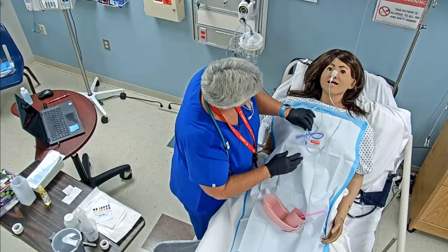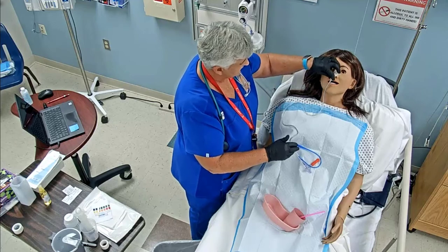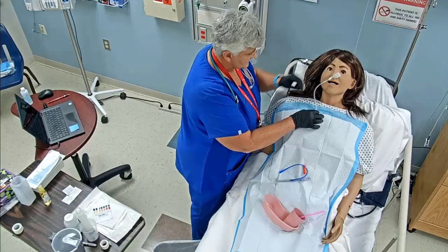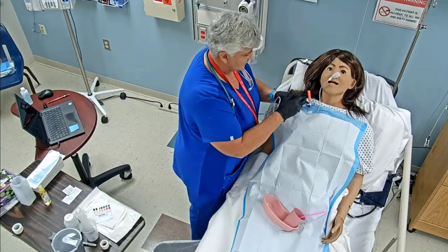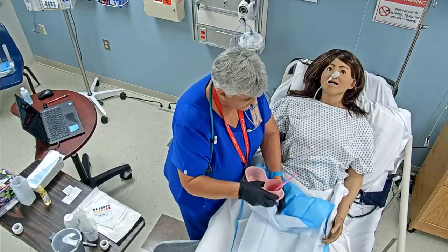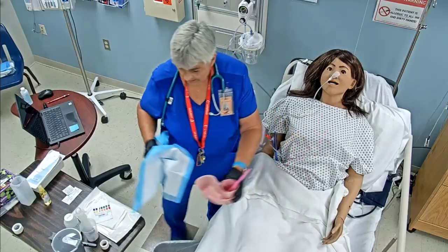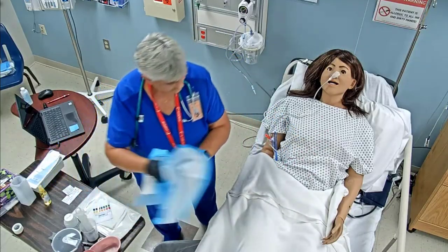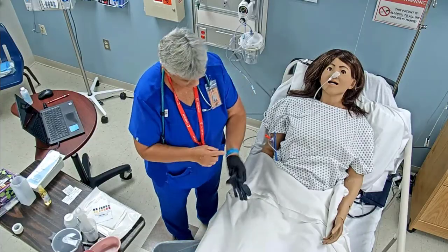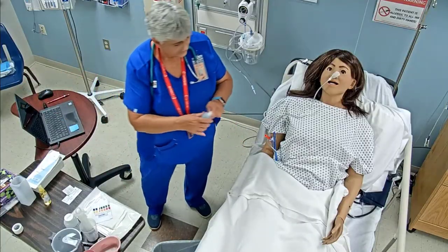Once we've got that in place, I just need to make sure that this isn't going to be tugging, because we inserted it to our mark, and we want to make sure that mark stays where it's at. Now I'm going to get rid of all of my stuff. We had them sip, swallow, and advance all at the same time. I'm going to take my gloves off, glove to glove, skin to skin, and do a medical hand wash.